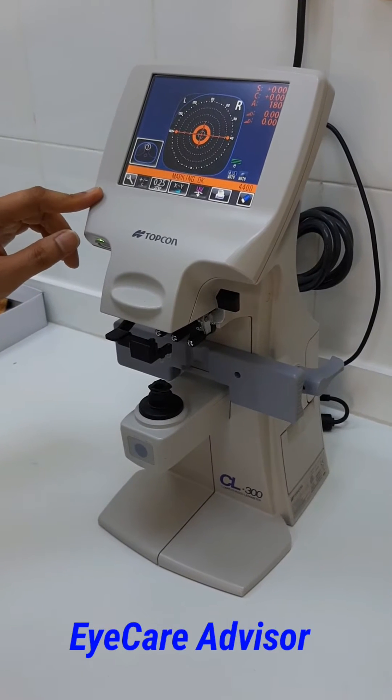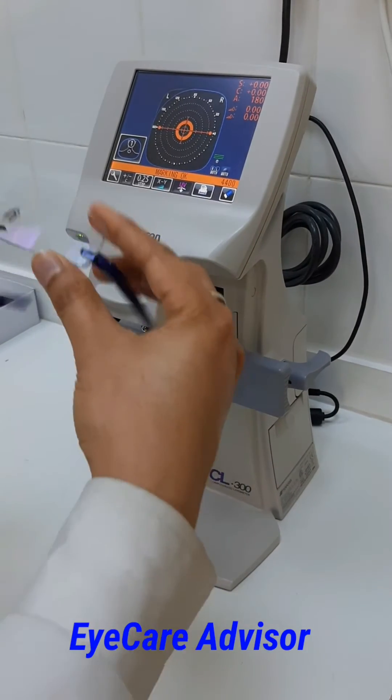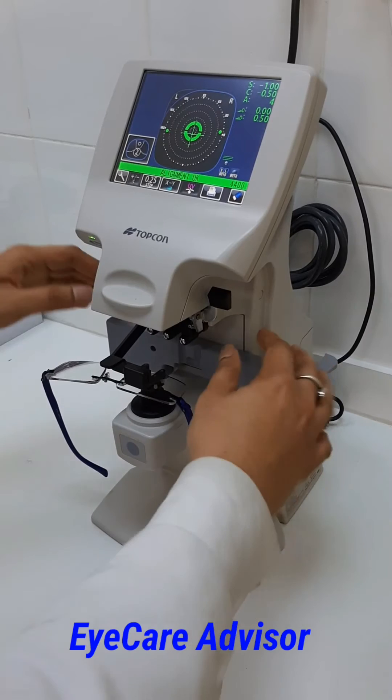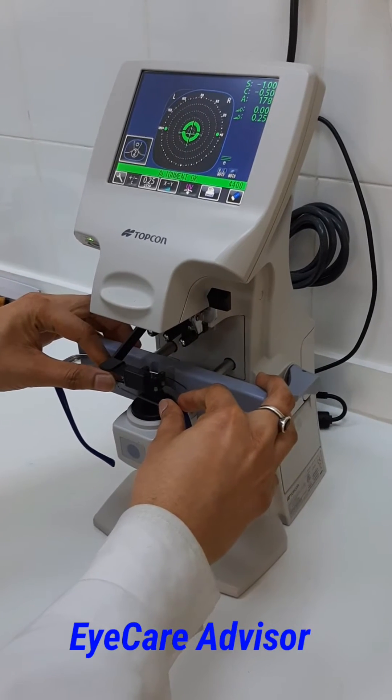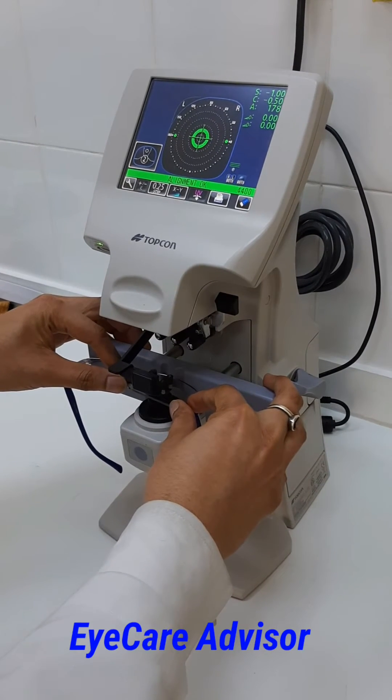First, I will show you how to measure the lenses for single vision. For example, this is a single vision lens — you just put it in and position the stand. Bring it forward so it is stable and will give the exact prescription. Just follow it and you will get the exact reading.